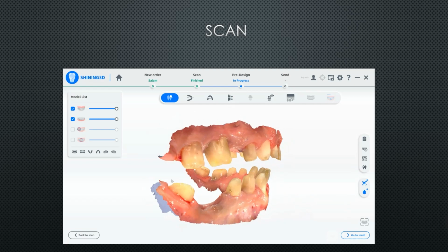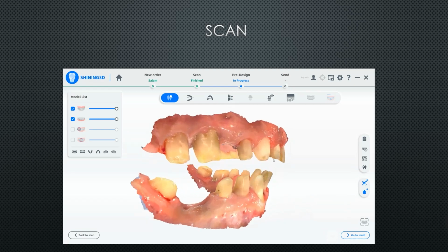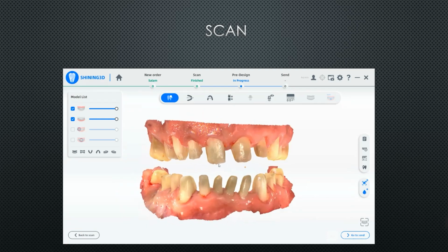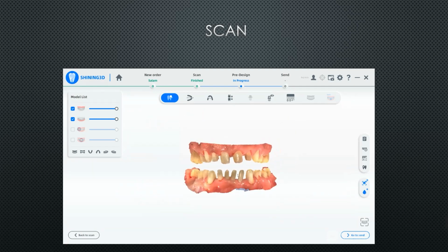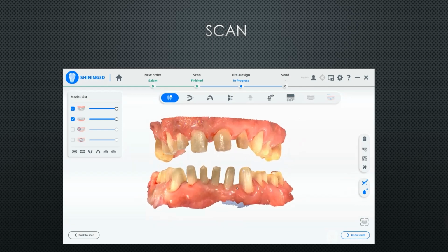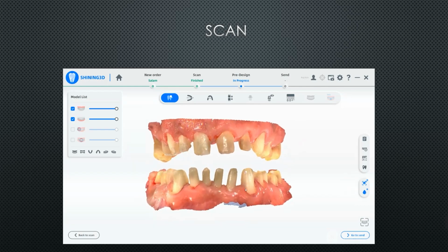You know, the patient is anesthetized from here to all his sides. So how you can take a new scan with a new vertical dimension. You have predetermined you need this vertical dimension. This will serve you. So there is a lot of benefits from this vertical dimension.